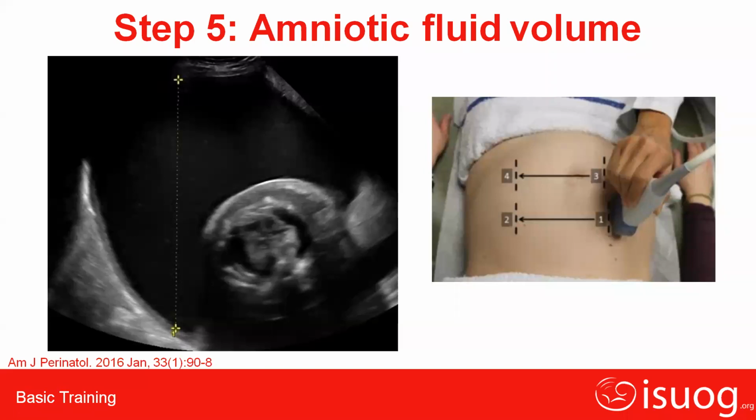Number 3, as we know, obesity significantly reduces the fluid measured because the fat scatters the ultrasound beam and introduces artificial echoes. In these patients, we have to use a lower frequency transducer. So in case of an obese patient, to avoid underestimating or overestimating the amniotic fluid, we have to use a lower frequency transducer. Number 4, free floating particles like vernix make the true amniotic space less conspicuous. So these are the 4 important things which we should be aware of when measuring the amniotic fluid volume.